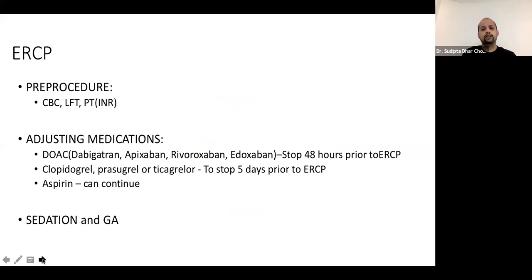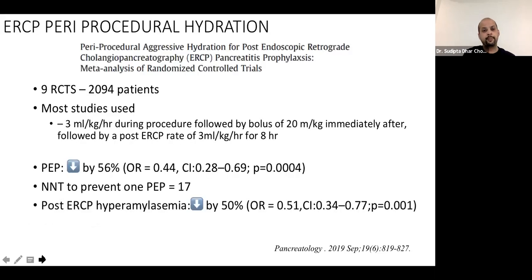So now coming to it, as Gaurav was saying, ERCP is now considered to be one of the standards of care in the management of CBD stone. Certain pre-procedural parameters need to be checked prior to doing an ERCP, primarily the CBC, the LFT patterns, and the PT-INR. A number of medications also need to be adjusted, primarily the DOACs, which need to be stopped at least 48 hours prior to ERCP. Clopidogrel and ticagrelor need to be stopped at least 5 days prior to ERCP. Aspirin can continue. Sedation and general anesthesia depend on the center at which you're working.